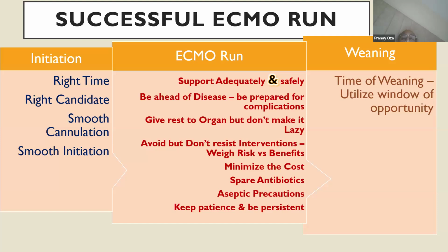Give rest to the lungs, but don't make it lazy. So don't just let lungs remain like that. You are not giving any PEEP, you are not giving any physiotherapy, you are not mobilizing the patient, not turning the patients. That is not going to help you. That is going to delay the lung recovery. That is going to delay the heart recovery. And as the number of ECMO days increases, it will increase the risk of complications.